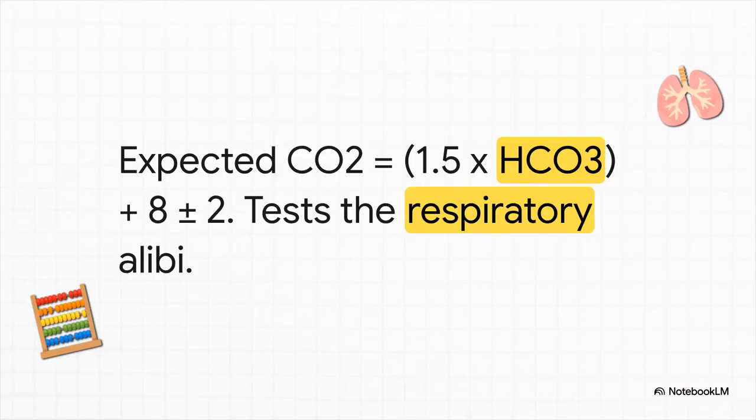This is your ultimate lie detector test for metabolic acidosis. If your patient has metabolic acidosis, their lungs should aggressively blow off carbon dioxide to compensate. This formula tells you exactly what their CO2 should be.